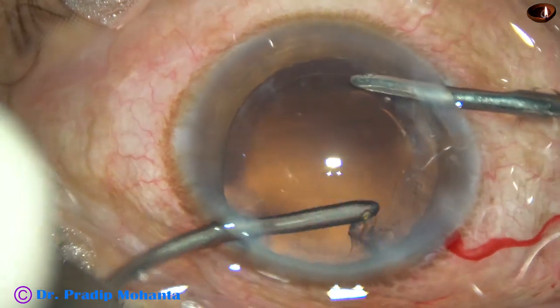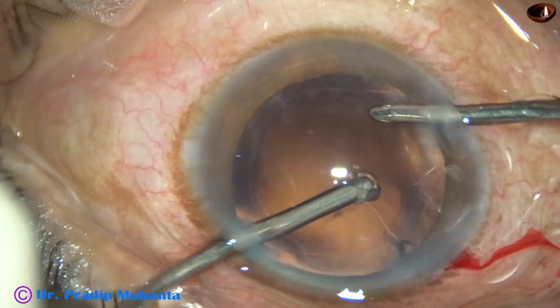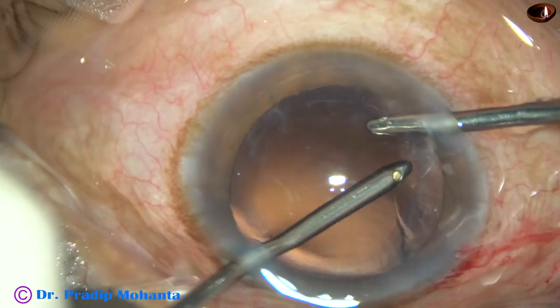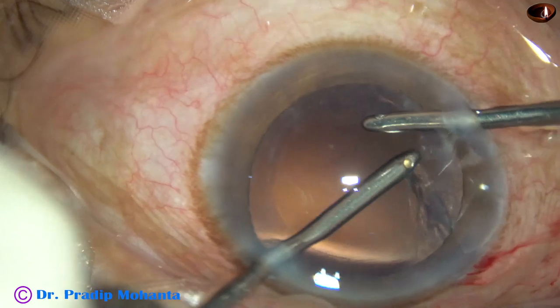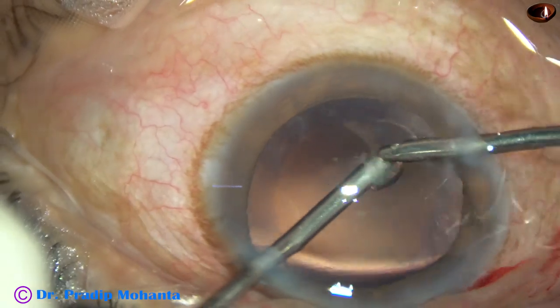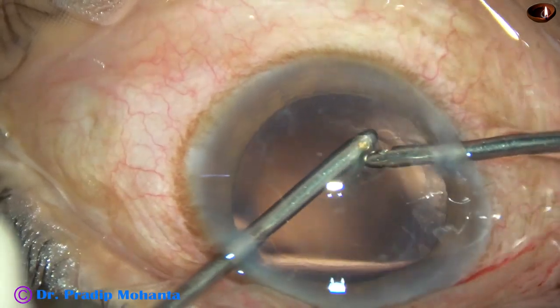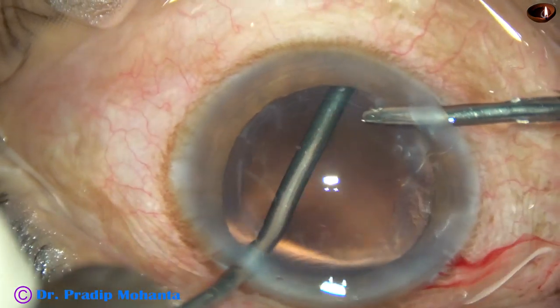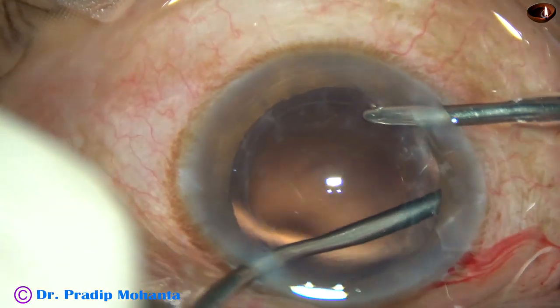After nucleus management, cortex cleanup is done nicely by bimanual irrigation-aspiration, or coaxial irrigation-aspiration using a thin slender 23G Simcoe cannula.